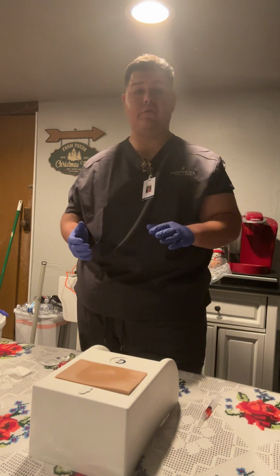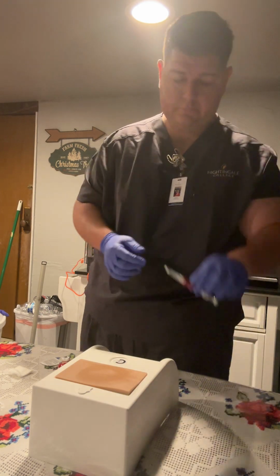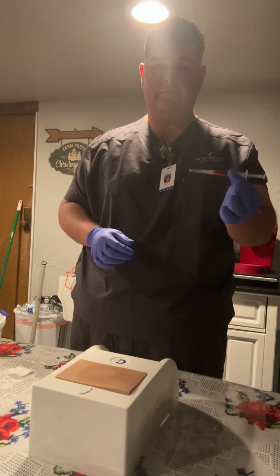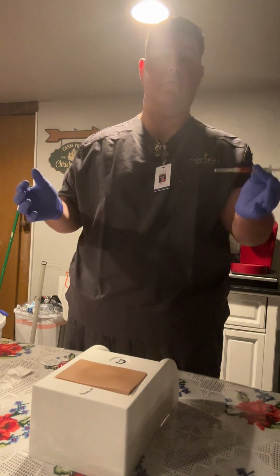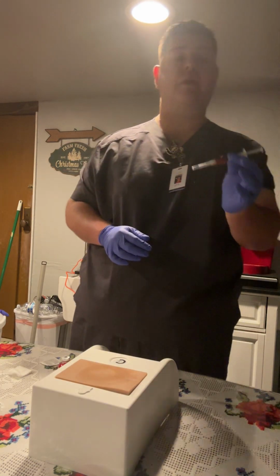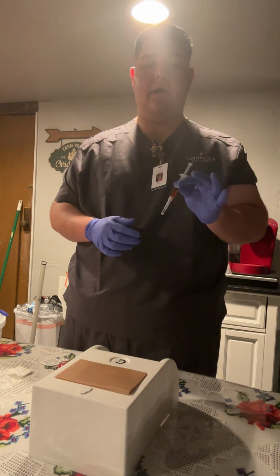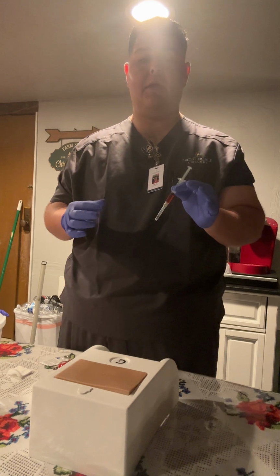With the syringe, I want to hold it in between my thumb and my index finger. My cap's on, and I want to remove the cap like a dart almost. I'm going to inject at a 90-degree angle, palm down, using the ulnar side of the hand.